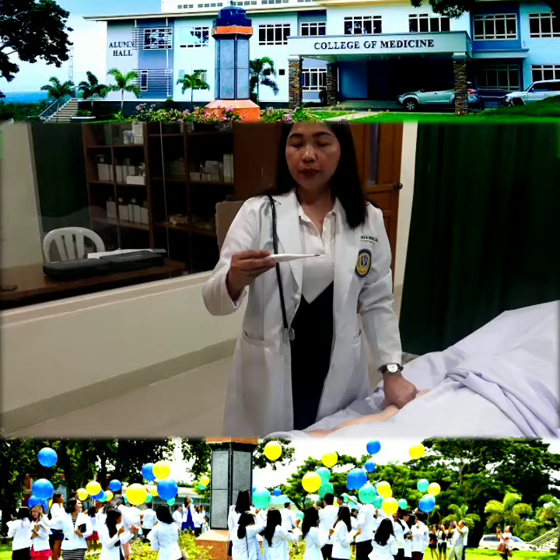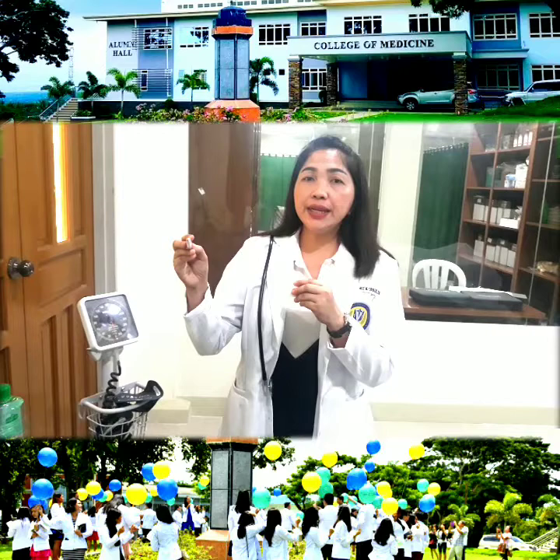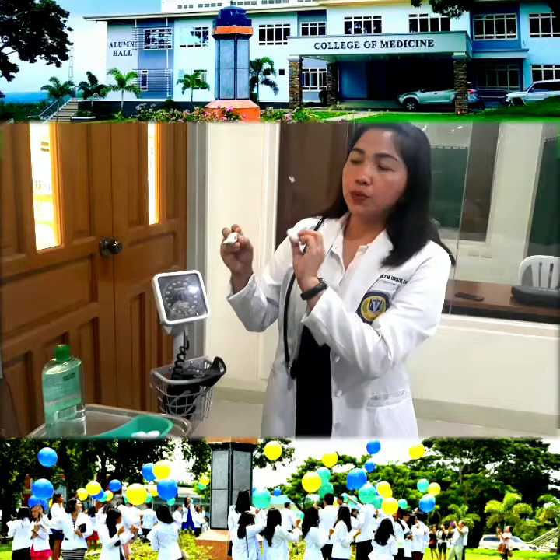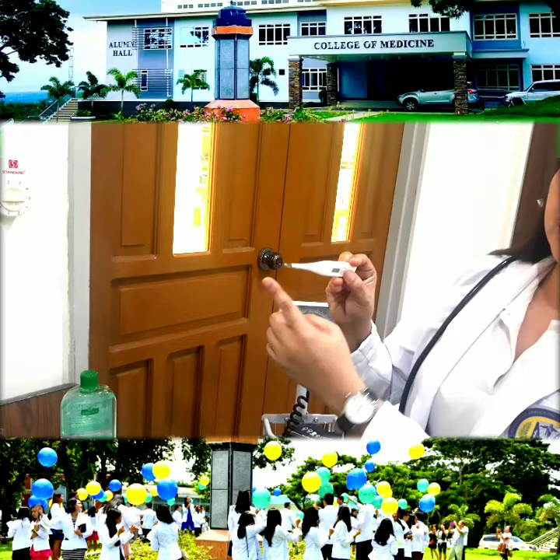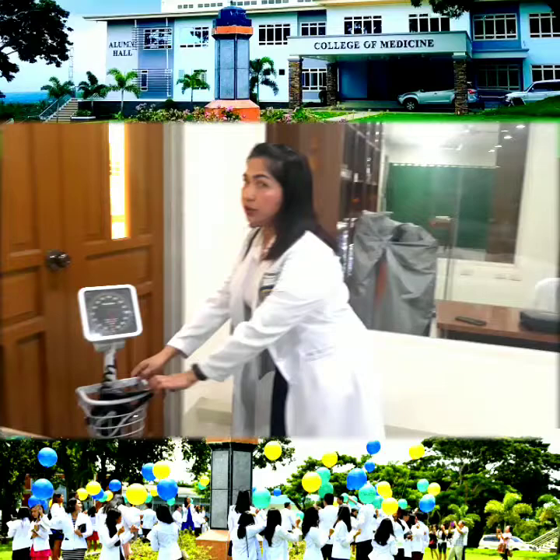After that, we take the thermometer and at eye level, you read it. Now that we're done, clean from the cleanest part to the dirtiest part. The tip has now become the dirtiest part, so we start cleaning from here going to the tip. We have cleaned this already and put it back.